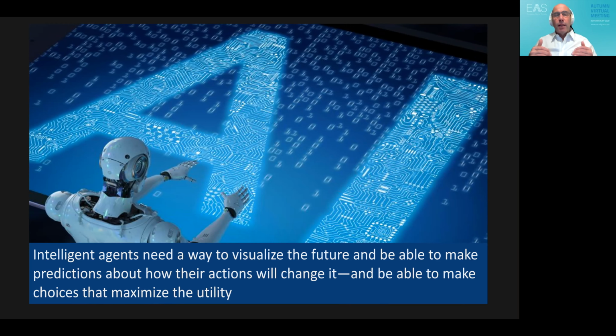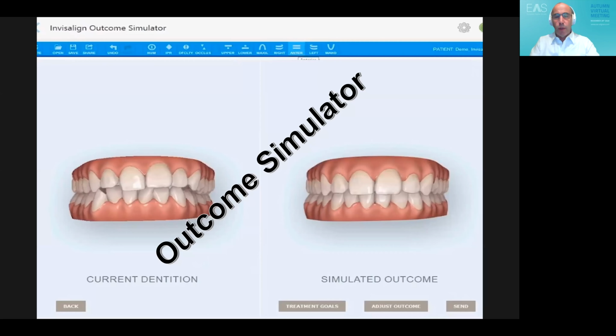So the artificial intelligence concept is based on the fact that what you have today is not what you will have tomorrow, meaning that all the time we get improvement. When we use the software and the data, we're actually helping ourselves to get a better suggestion from the artificial intelligence algorithm. Now, what is Outcome Simulator?